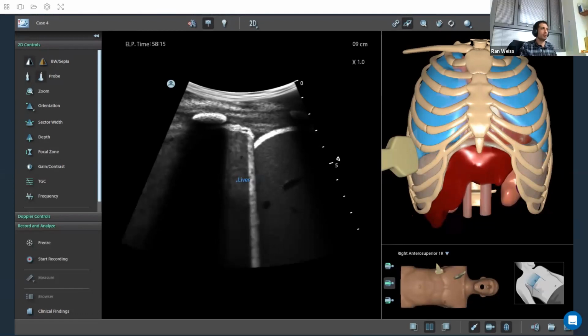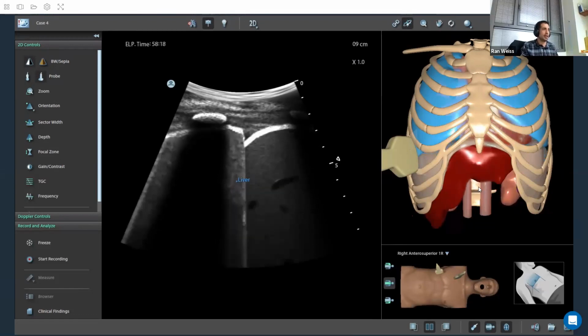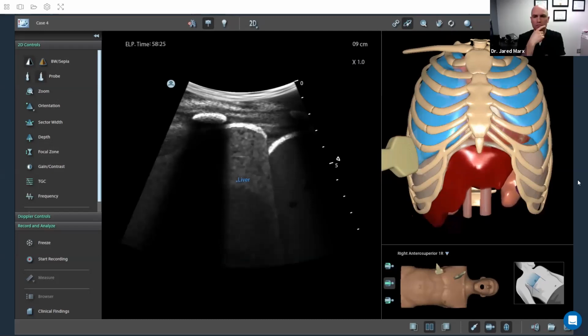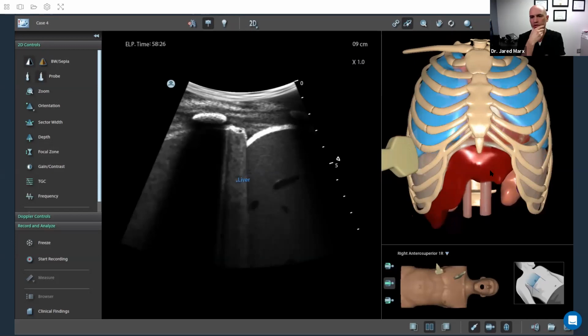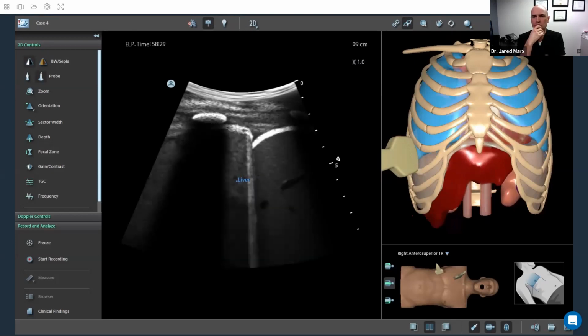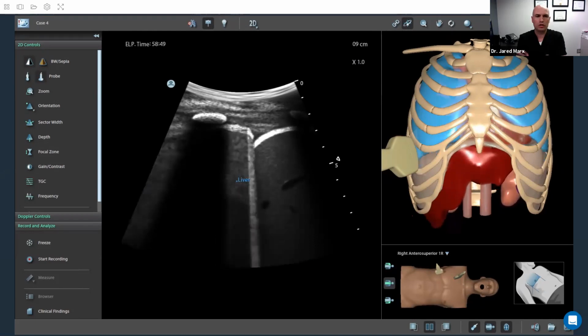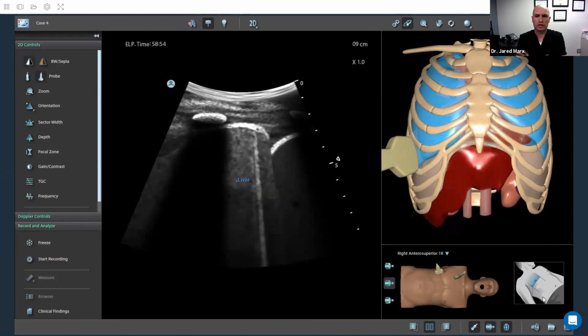Yeah, so actually in the severe case, we are also showing a large consolidation with the air bronchograms. Yep, you do. I've reviewed them all, and they're a great example of what you'll see. And maybe we can discuss, we also have some echocardiographic cases. Maybe you can refer to cases that may be seen on an echo related to COVID-19. I think it would be great to show them your module on an echo. I think pulling up one of those would be a great idea.